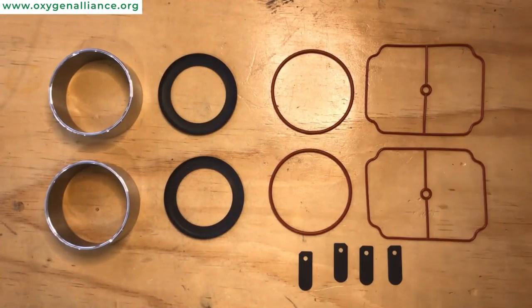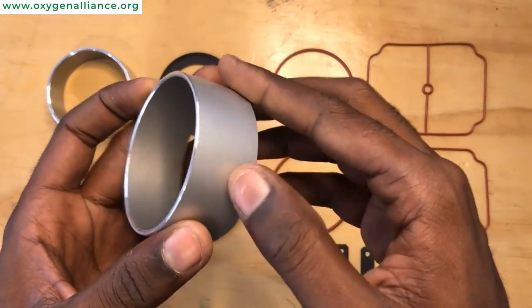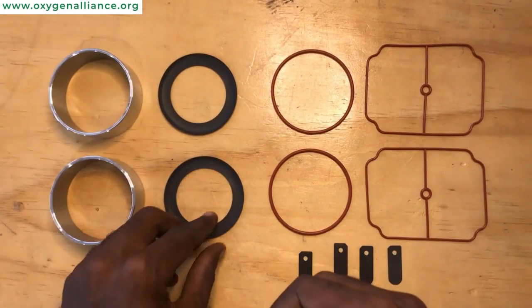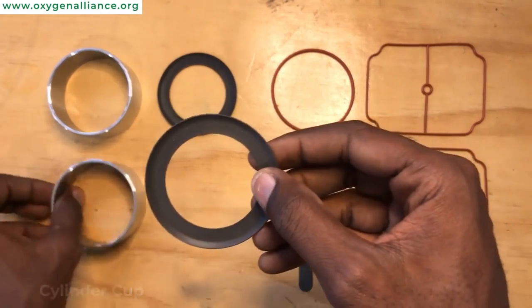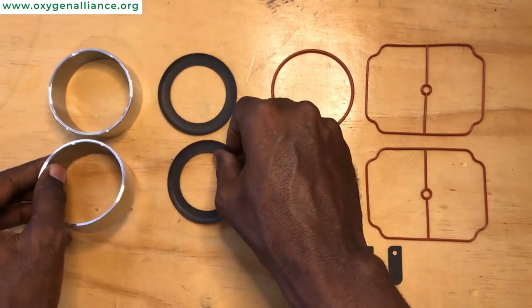For the replacement service kits you must have the cylinder sleeve, which is where the compression takes place. You also need the cylinder cup — the cylinder cup goes inside the cylinder sleeve and is there to provide a tight seal inside the cylinder sleeve during suction and compression.